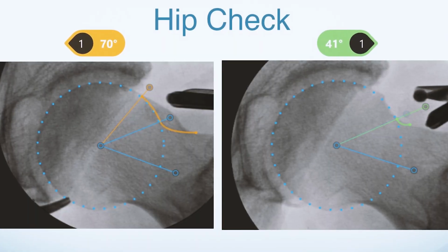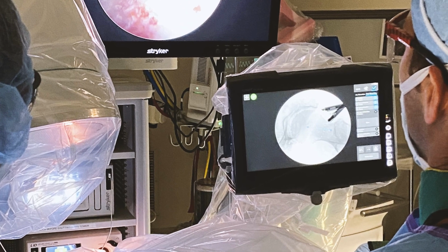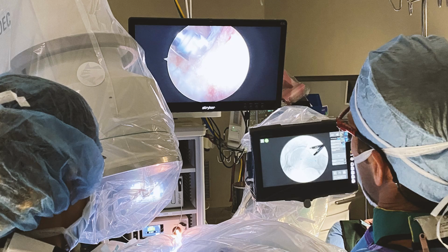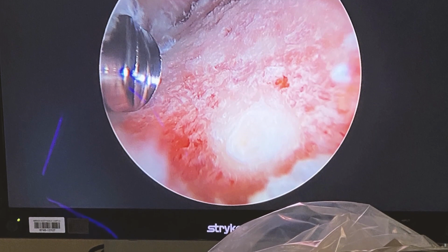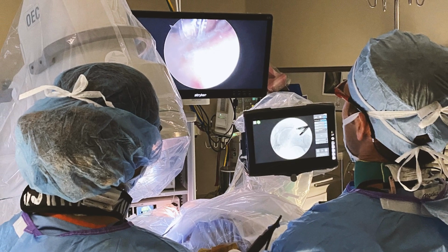Another technique that we're using in the operating room and technology is HipCheck. What HipCheck is, we use fluoroscopic guided femoral osteoplasty, which is fancy words for resecting the bone on the femoral neck, which causes the labrum to tear. We're able to more precisely resect that bone now using HipCheck, which uses a software program that looks at how much bone to resect and make sure that we do not over resect or under resect. And it gives us more reliable, reproducible results with our surgery.